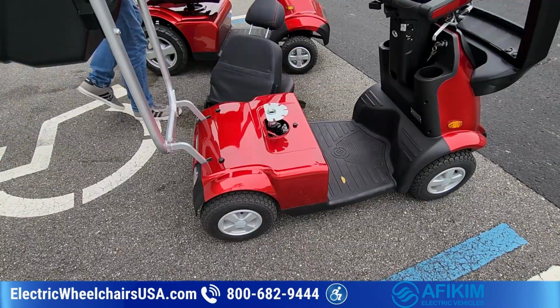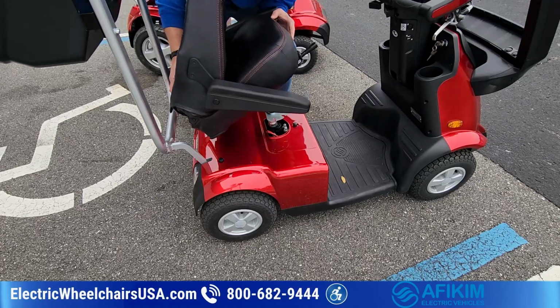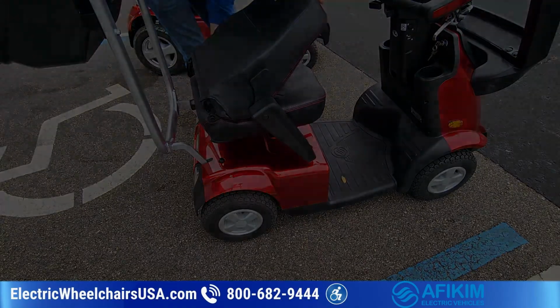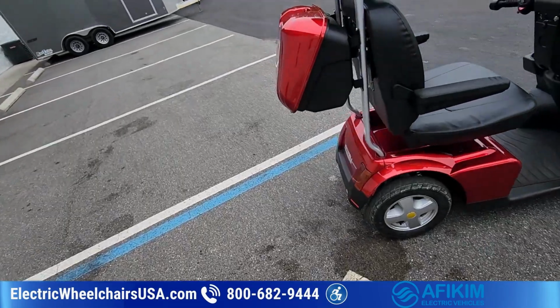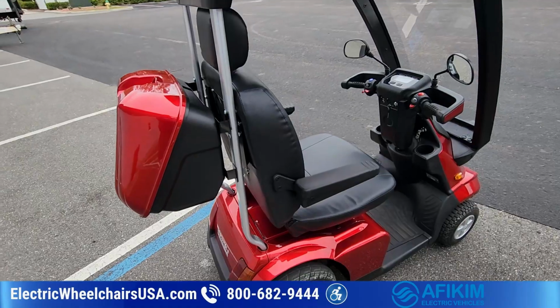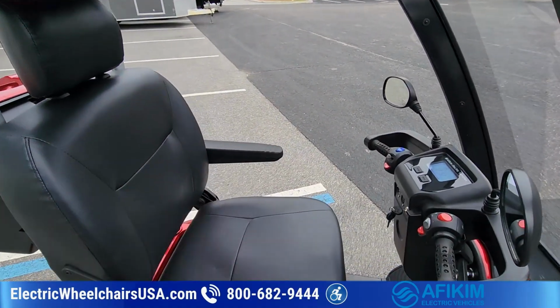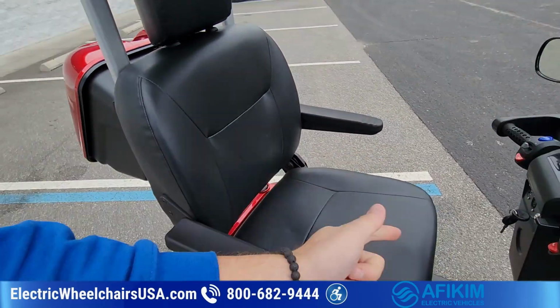So now I've screwed those on, and then just line up the seat post with the hole, and that's it. So that's all the customization on the C model. Now, customization on the S model is a lot more. So you got, again, it comes standard with the 20-inch wide seat. You can get a 22-inch, 24-inch, which is this one, or the 33-inch wide dual seat.